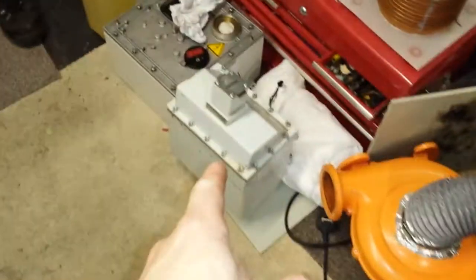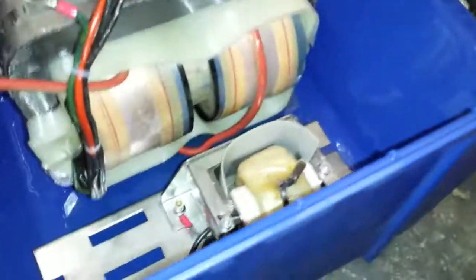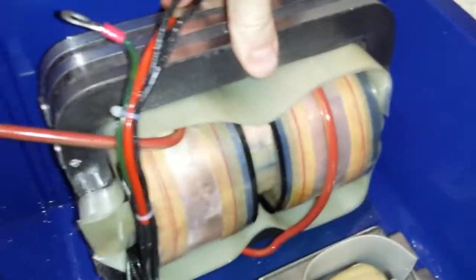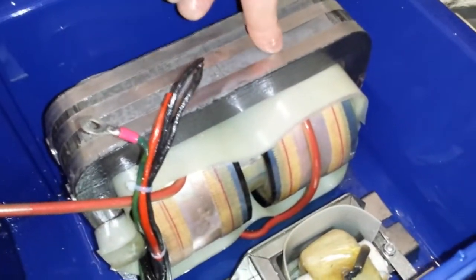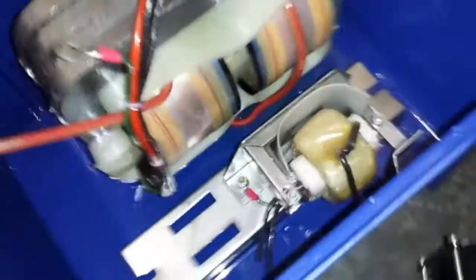Well, I've taken the transformer out of that one, and I've got it over here. It's a 90 kV transformer. Very nice, isn't it? And that's the filament transformer just there. It's 90 kV at around 8 milliamps. And yeah, no, it's gorgeous. Does look nice.